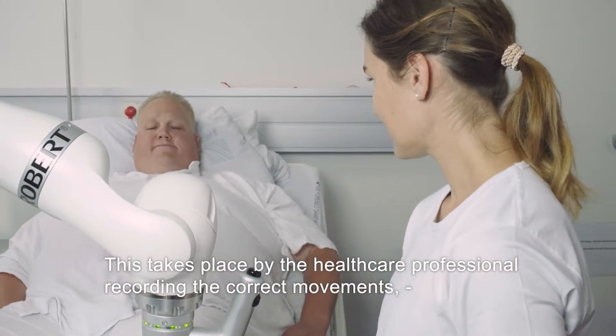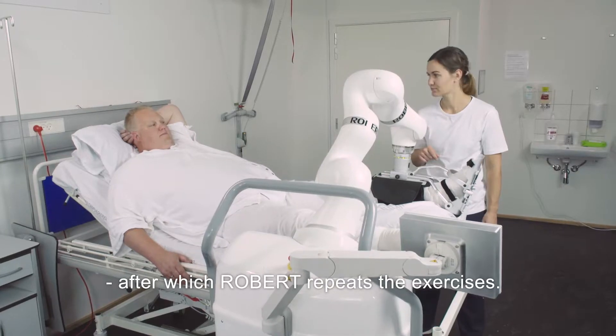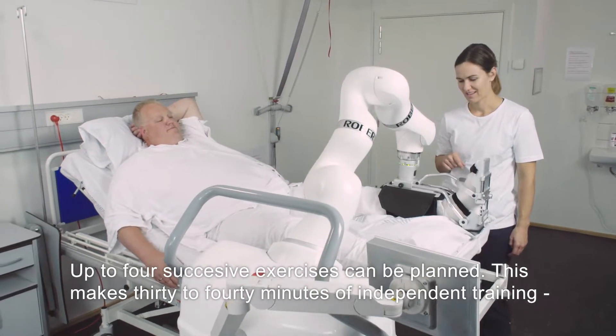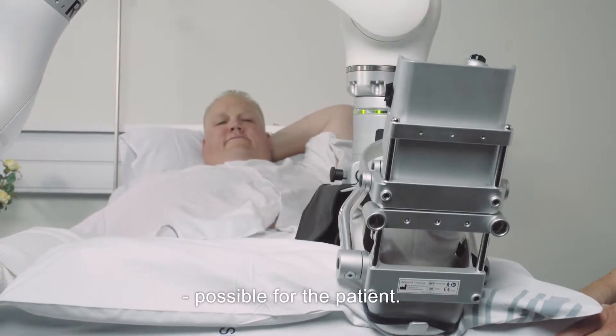This takes place by the healthcare professional recording the correct movements, after which Robert repeats the exercises. Up to four successive exercises can be planned, making 30 to 40 minutes of independent training possible for the patient.